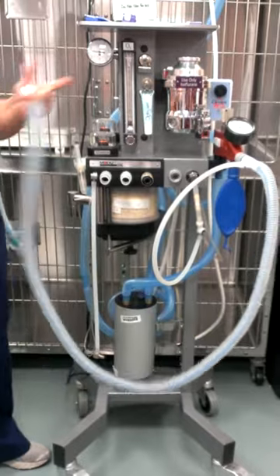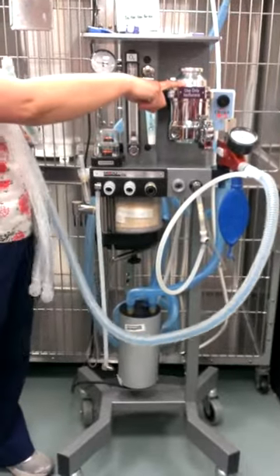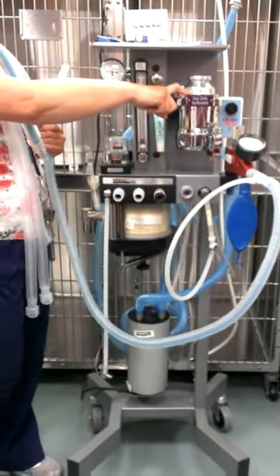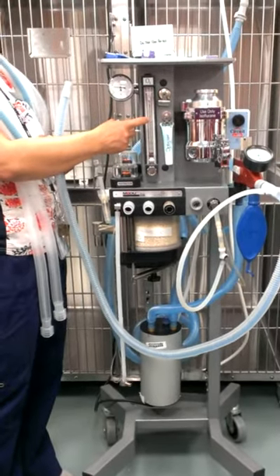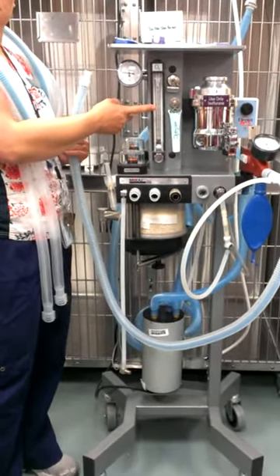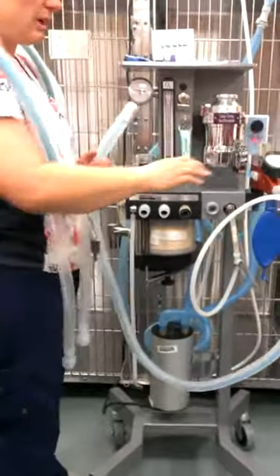Most machines out there don't have this handy-dandy push feature — most you have to screw them down. I don't think I've ever seen an alarm out in practice to say the pressure is too high; it's an add-on feature this machine has. So that's the Bain system. The vaporizer is the ISO. What's this? The flow meter. The minimum we run our oxygen at is one liter.